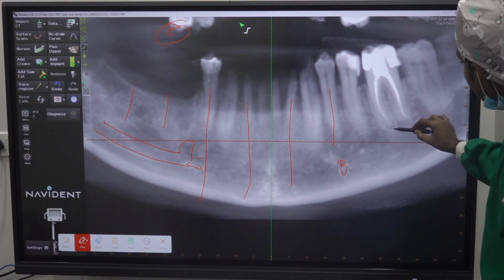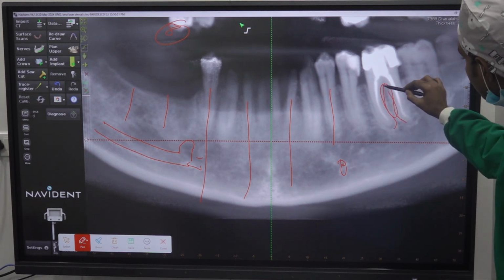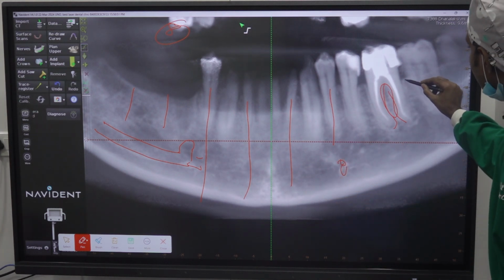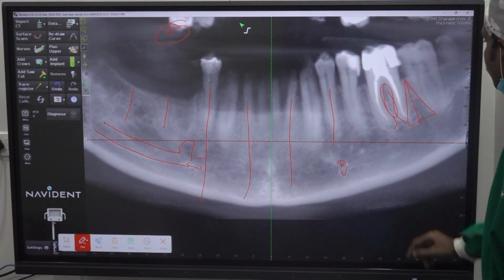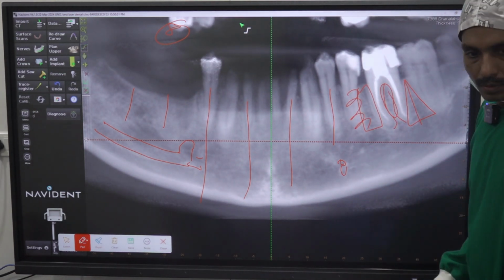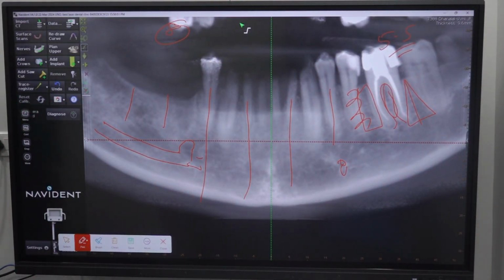The moment you extract, can you see this interdental bone is like this. This plate also will come along with the extraction. Yes, because this part is locked within the root. So in this socket, placing a good implant may not be possible because it will be a big empty socket. So better to place an implant in this interdental bone, right? And we can place one implant in this interdental bone or place a wide basal, 5.5 in the premolar. Okay, this is our tentative plan.